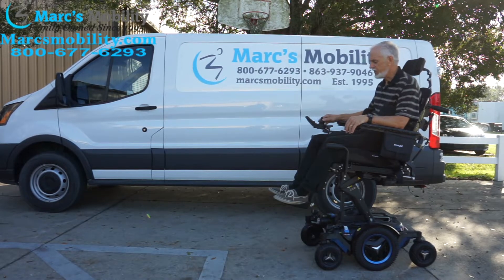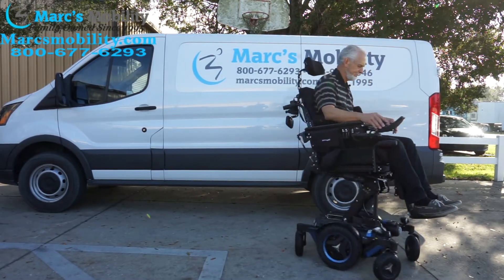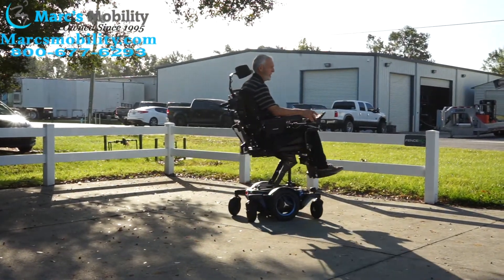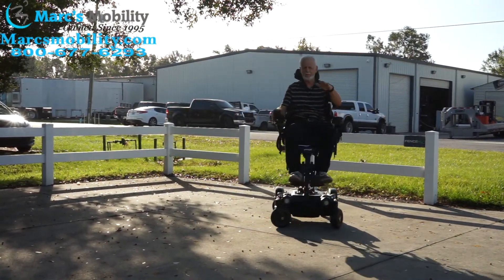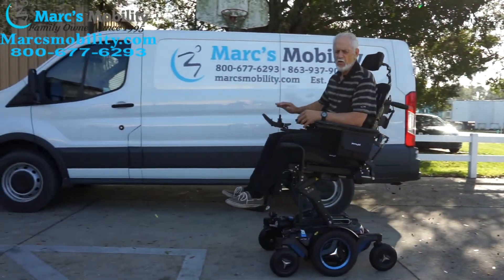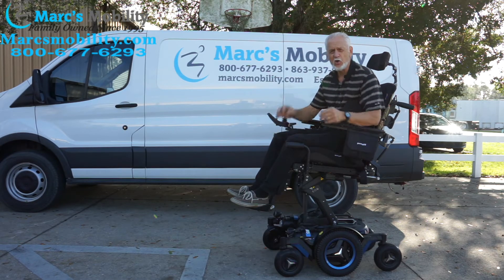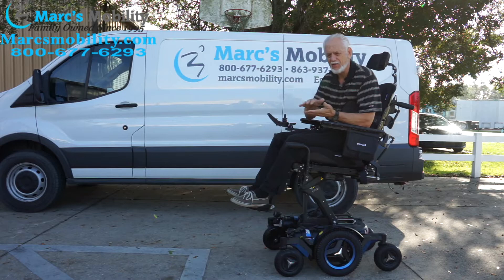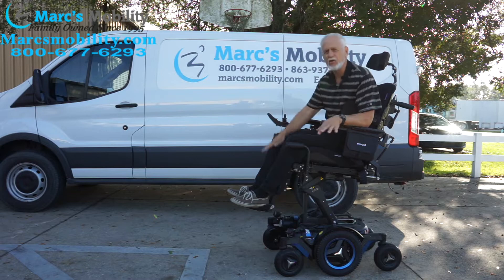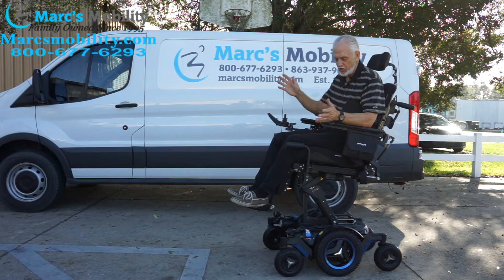This chair has 13 miles on it. Here we go — turning around to show how fast it goes with the seat elevated. With the seat elevated, this chair drives at 3.3 miles an hour. Walking speed is about two to two and a half. Once you bring the seat all the way back down it'll go seven and a half miles an hour. If the seat is elevated at all, you'll lose speed — there are sensors on these chairs for your safety.